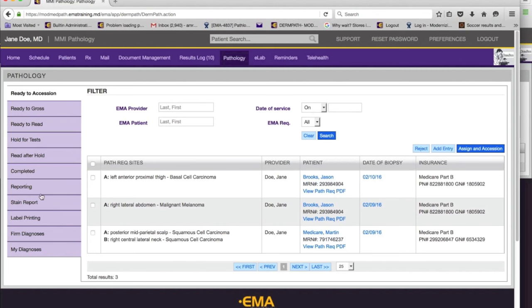Then you have the completed screen where you sign the reports, and we have two extensive reporting screens. The reporting screen covers all the activity in the lab. The stain report covers everything related to immunohistochemistry stains or additional stains that are ordered. We also support printing of slide labels — the ones that are about one inch squared or 15/16 inch squared. If you have multiple pathologists in-house, they can customize their own diagnoses that are not shared with other pathologists.